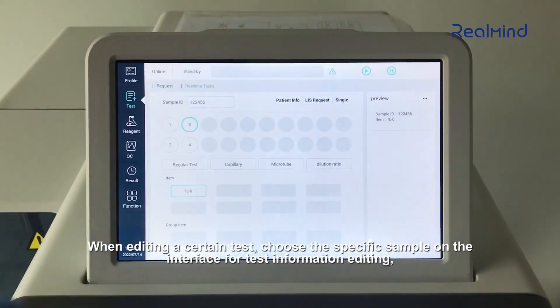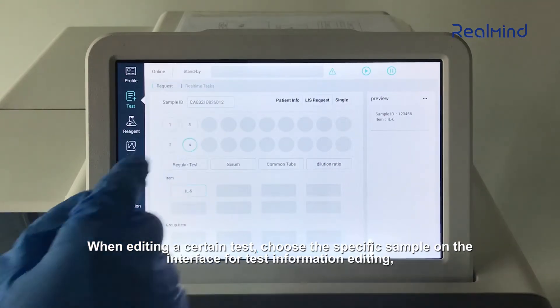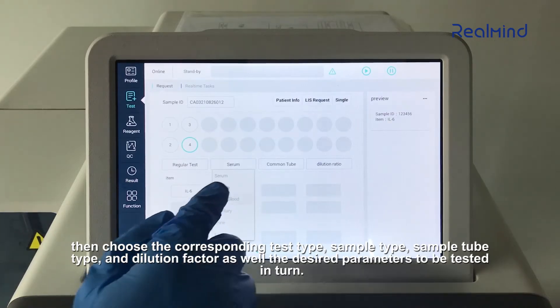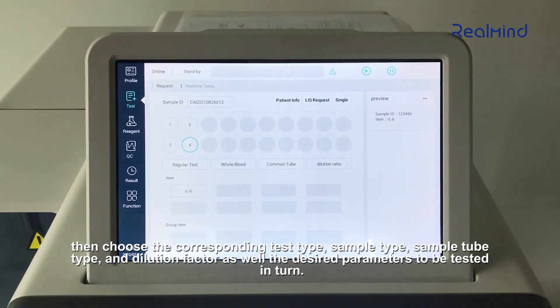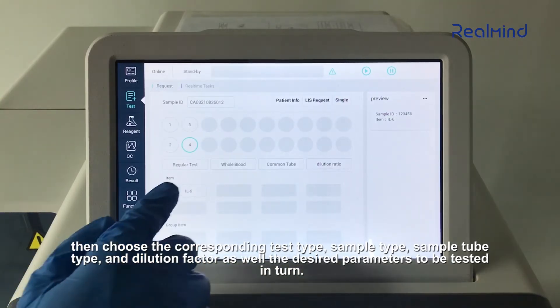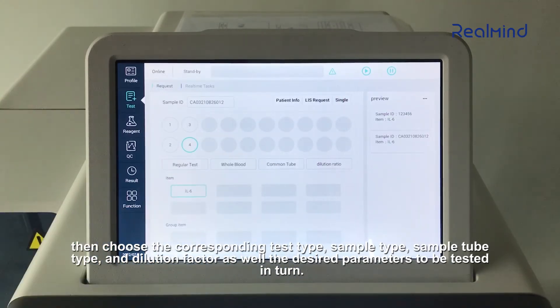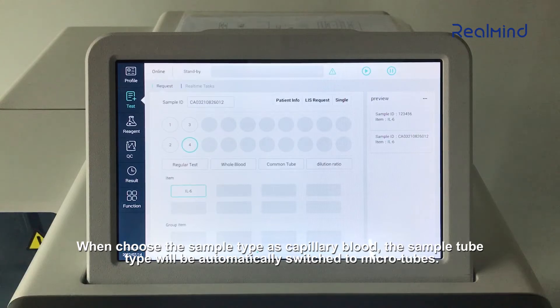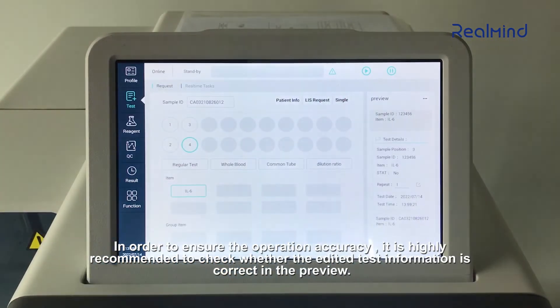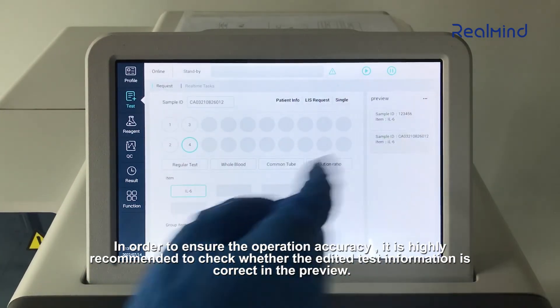When editing a certain test, choose the specific sample on the interface for test information editing. Then choose the corresponding test type, sample type, sample tube type, and dilution factor, as well as the desired parameters to be tested. When choosing the sample type as capillary blood, the sample tube type will be automatically switched to microtubes. It is highly recommended to check whether the edited test information is correct in the preview.